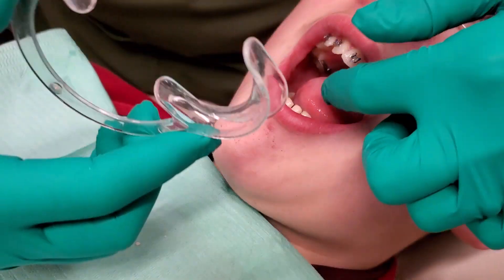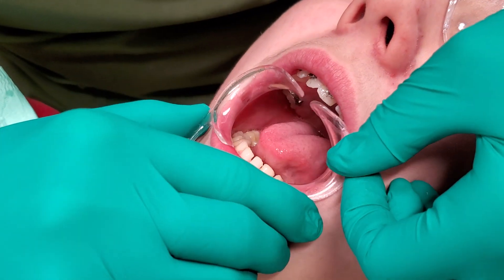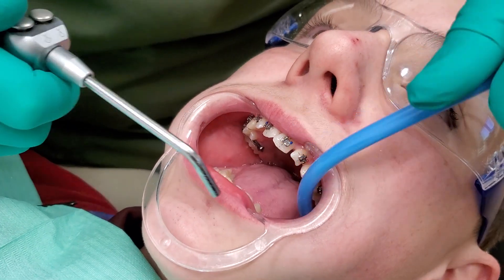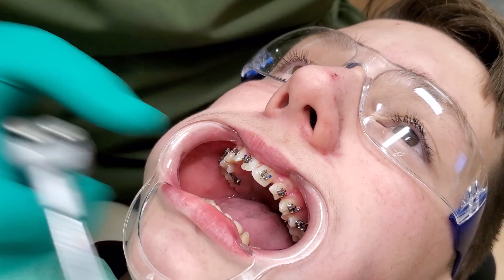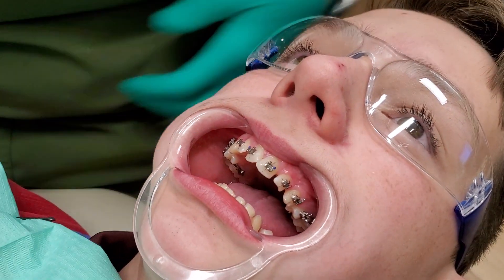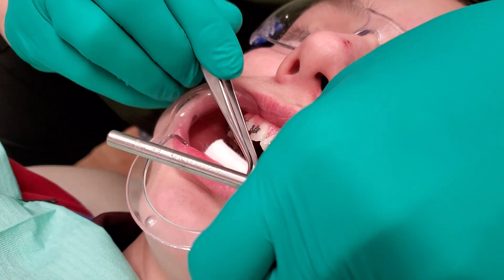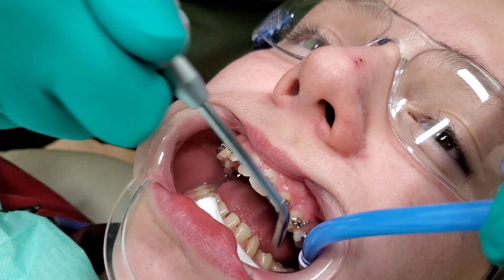I like these little cheek retractors. Everybody does it kind of a little different — whatever works for you. So stay open. Try and just keep your tongue relaxed. I'll push it out of the way — just let me push it wherever I'm moving, pushing it out of the way. Don't try and fight me, or don't try and help me. I think I can do this part without cotton by the tongue yet. I'm going to put a little out here — just hold your lip for me. Just stay open, just dry it a little bit.